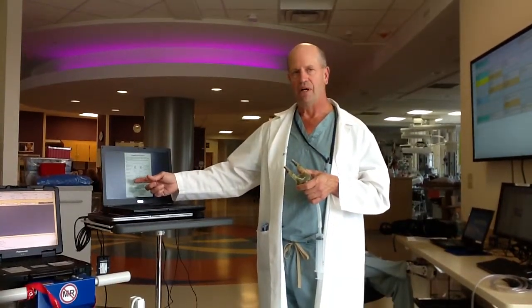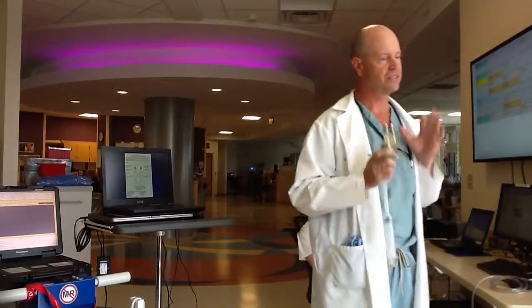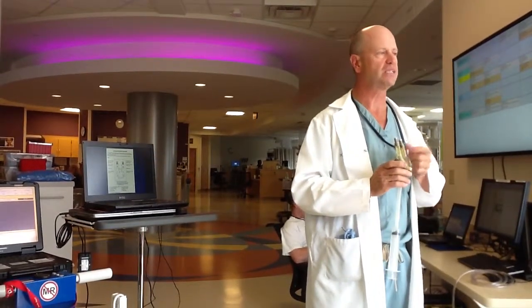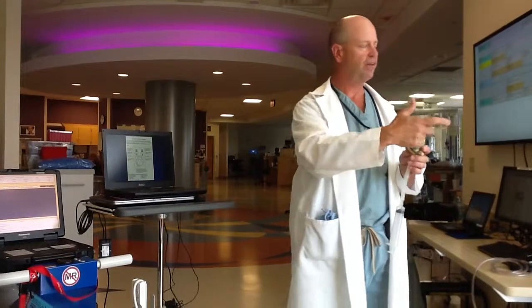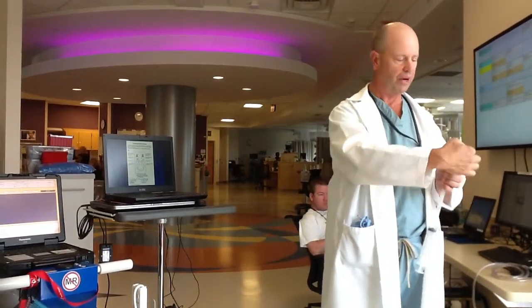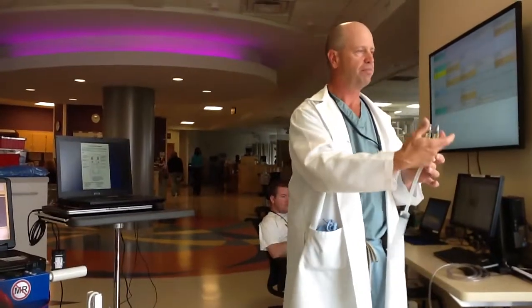Thrombus inside the pump: we are using the sheets for that because there's no way to put it in the computer. This is very subjective, but we have to have some way to track those deposits inside the device. On this sheet, every area of the pump has a number — the inflow, outflow, the top, and so on. There are numbers assigned to every area of the pump.